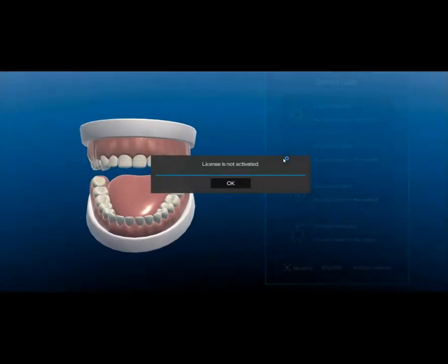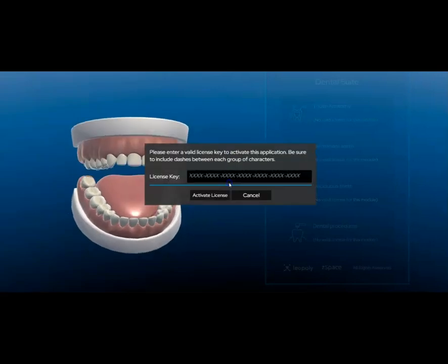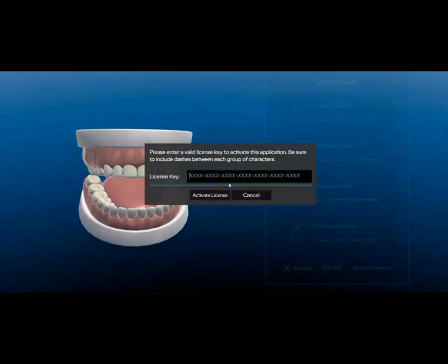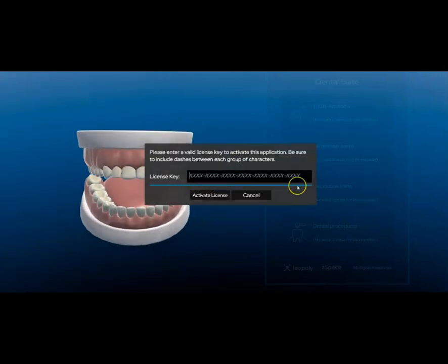Here, you're able to license your application. Either type or copy and paste your license key in and click Activate License.